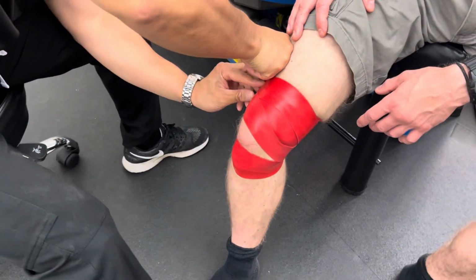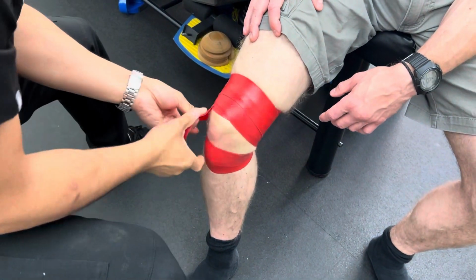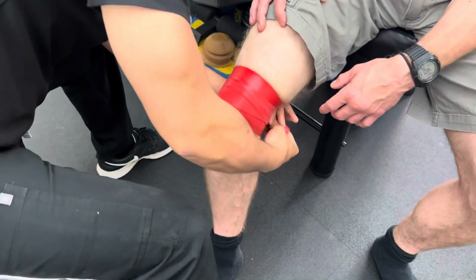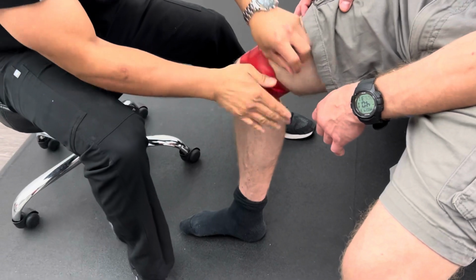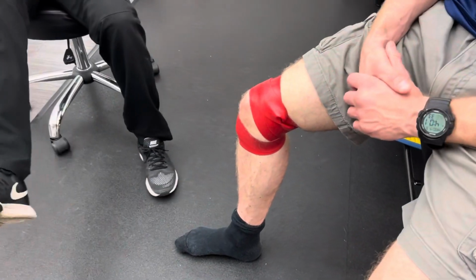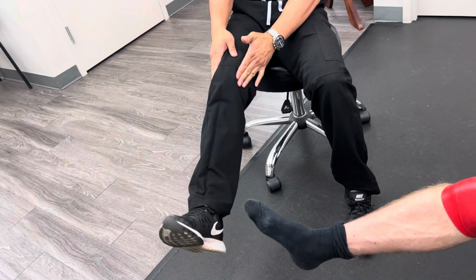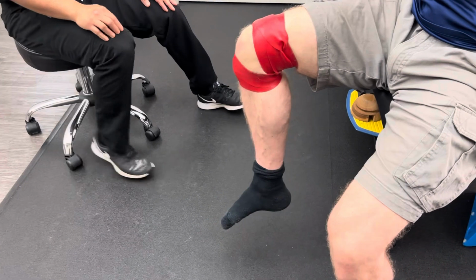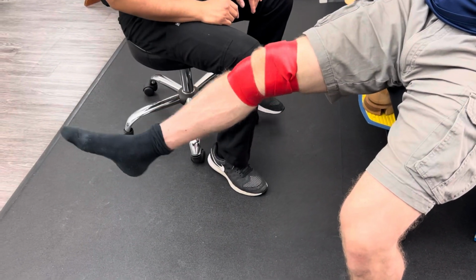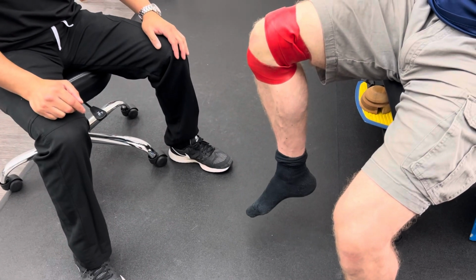There's a lot of different ways to wrap it, making it nice and tight for him. The last part's tricky as we tuck it in. This is real time, folks, so no editing here. Just like how we do with ART, we're going to start with the knee in extension as best you can, and then fully flex it as best we can. Okay? Yep. Go ahead, keep going. A couple of passes. May even have you do it in a squatted position.